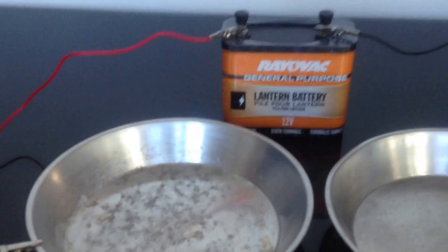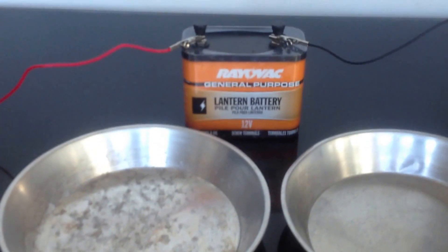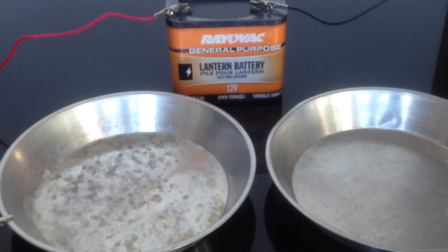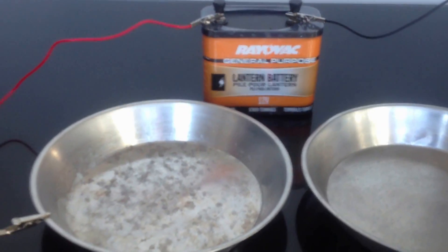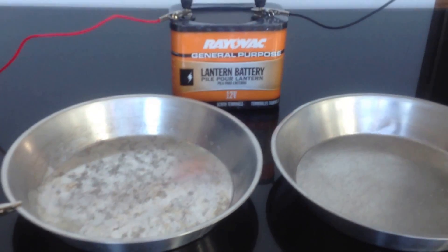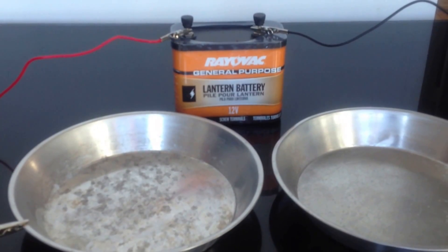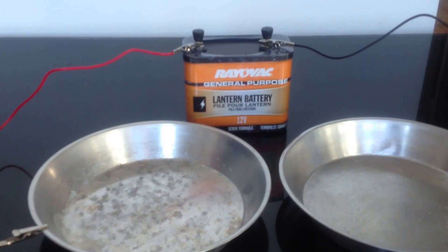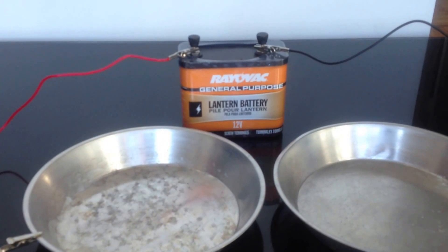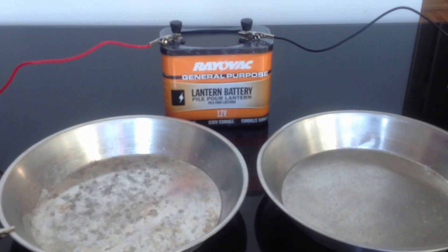All you need to do now is put some water in each of the plates and put your hands in. Once you put your hands in, it will sting a bit, but it's not really much — it's just a 12-volt battery, it can't really harm you. I use it for around 10 minutes every week, and so far it has worked out well for me. I hope it works well for you as well.